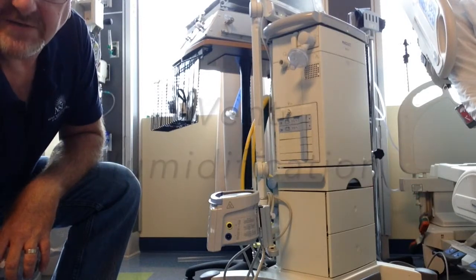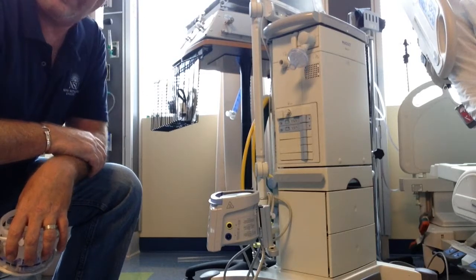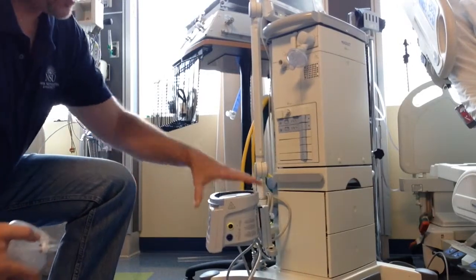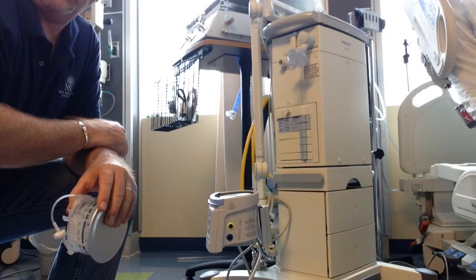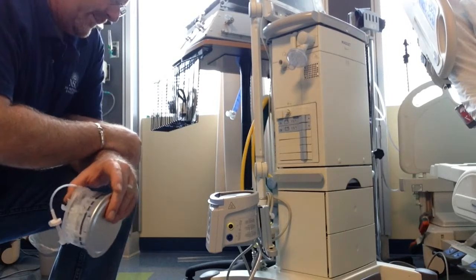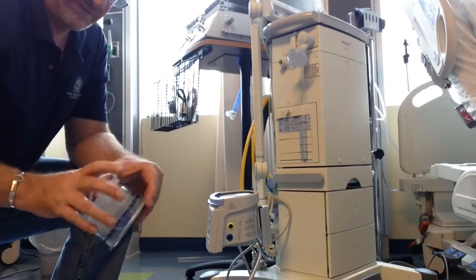Today we're going to be setting up an active humidification system on a ventilator using the Fisher Paykel 850. The process would be roughly the same with any humidification system you'd be using. We do not have the Neptune set up right now, but we will be going over that one — setting it up is the same, and the only thing different would be your wires.